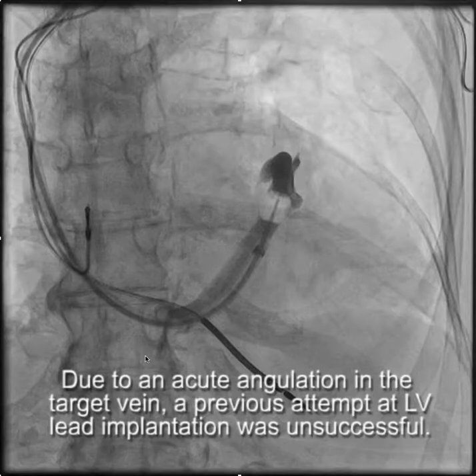Hello, this is a video demonstrating the different shapes of the vein selector, which is part of the Worley LV lead delivery system.